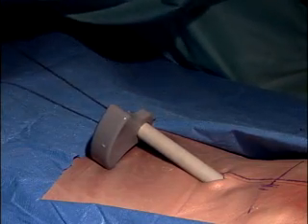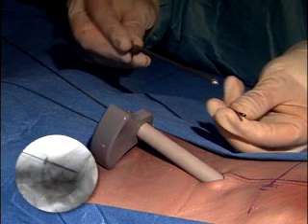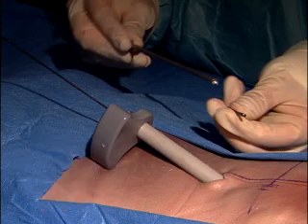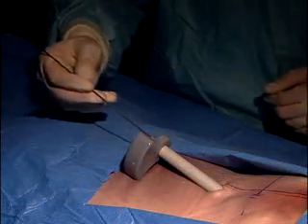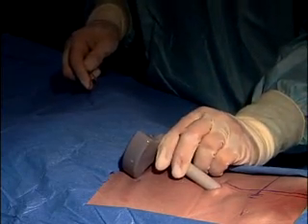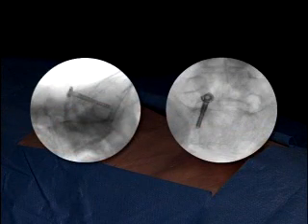At this point, the pull pin remover can be removed from the site, making sure to verify that the pull pin is still engaged with the pull pin remover. Final images are taken. The guide wire is removed, followed by the removal of the teleport tissue retractor. Final images of the bone lock implant in lateral and AP views.